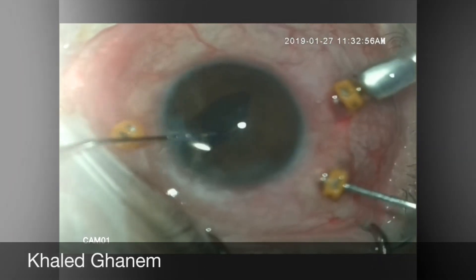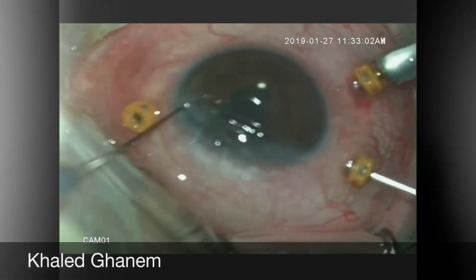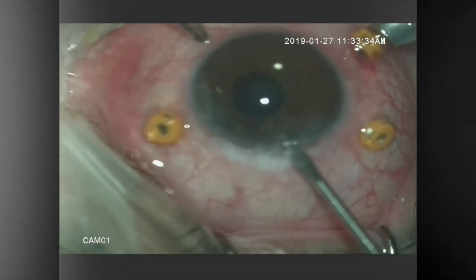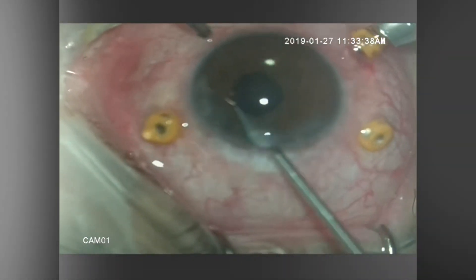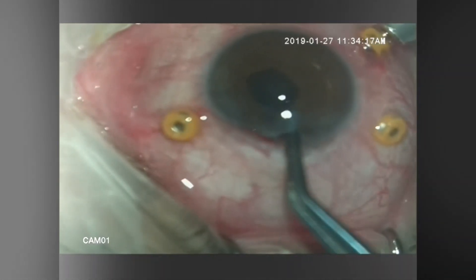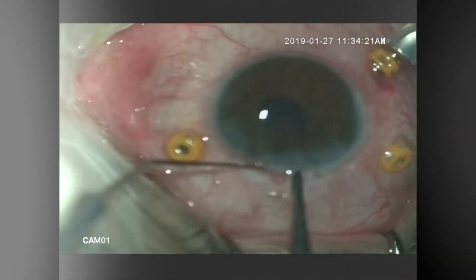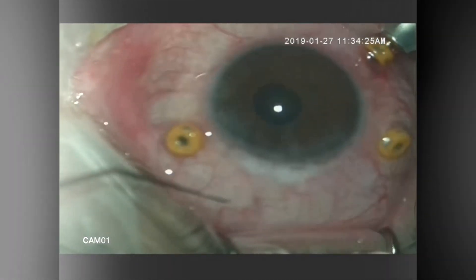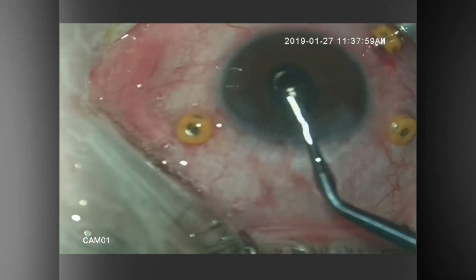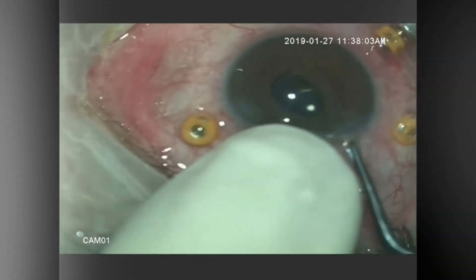As you see here, the iris is pushed downward until the entire IOL is delivered into the anterior chamber. However, as I said before, if you are planning to explant the IOL and implant another one, it is much easier to just exteriorize one haptic.